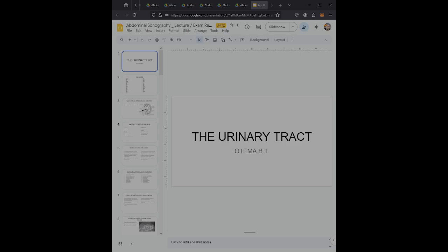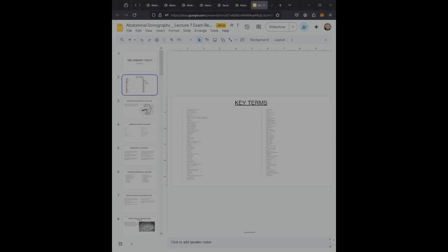Alright, we are going to go over the urinary tract, and this again is one of the lectures in the series of abdominal sonography. So, we're going to go over the anatomy of the kidneys, the ureters, and the bladder, as well as pathology, and we're going to look at some vascular anatomy and some renal vascular complications and basic transplant assessment.